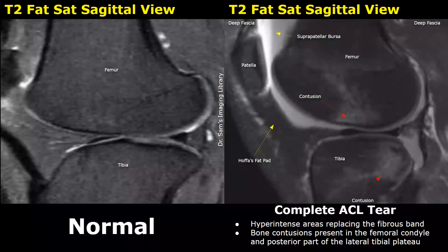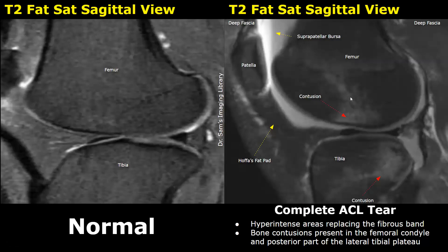In this image, we can see more bone contusions. These are T2 fat-saturated images. In the normal image, we do not see any focal hyperintense areas within the femur and the tibia — they are clear. But in the image on the right, we can see hyperintense, ill-defined areas in the femur and the tibia, due to trauma, and these can be associated with ACL tears.